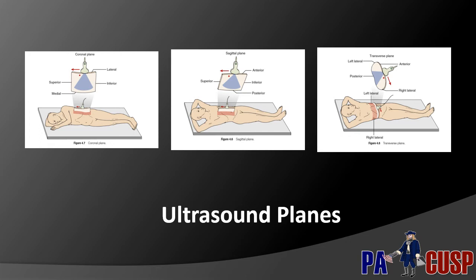As you move the ultrasound machine around the patient's body or you change your orientation, such as if you're standing at the head and doing an IJ, it's easy to flip that orientation. So a simple check before you start imaging will help keep yourself in the correct orientation here.